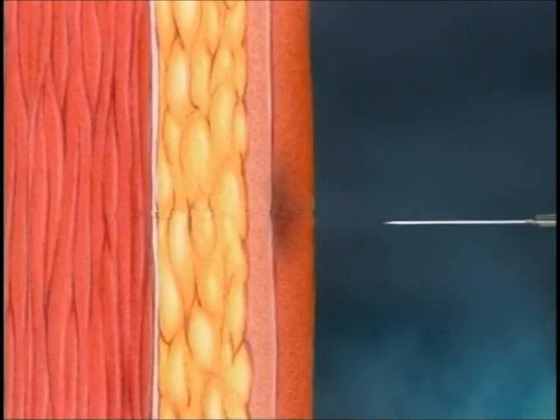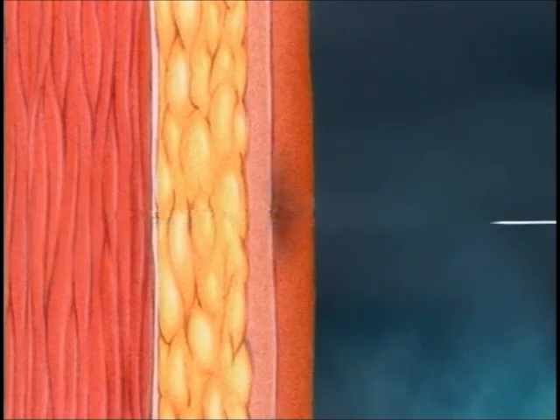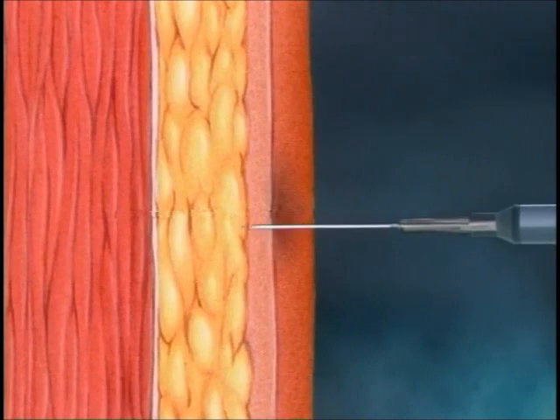Because the effectiveness or efficacy of the vaccine depends on using the proper site, the right needle, and the proper route. An intramuscular vaccine is intended for the muscle. Vaccine injected deep into muscle tissue is absorbed efficiently and gradually into the bloodstream. But when a vaccine that should go into the muscle is deposited in subcutaneous tissue instead, efficacy is compromised.